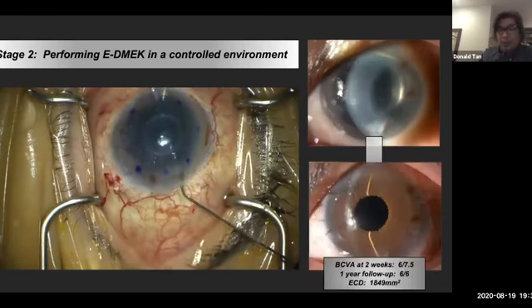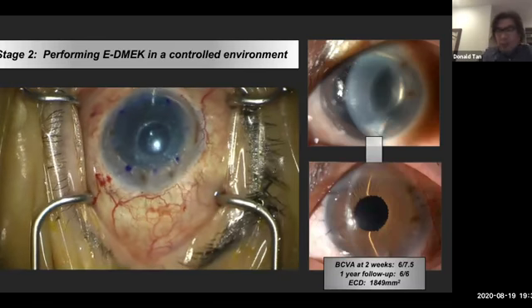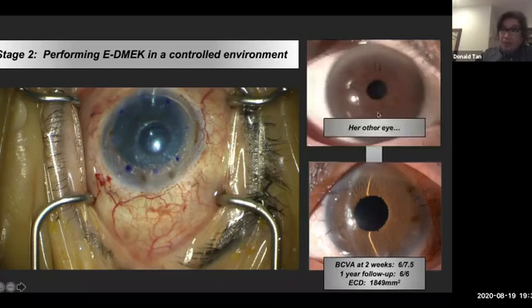This is what the patient looks like. Amazingly, this patient achieved 20/25, 6/7.5 vision in 2 weeks. And it's been a year since we've done this case now, one of our first few cases. And this patient has a cell count of about 1,800. This is her other eye, just to show you in compare and contrast. So quite similar.